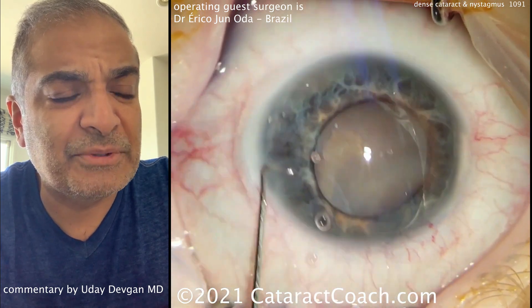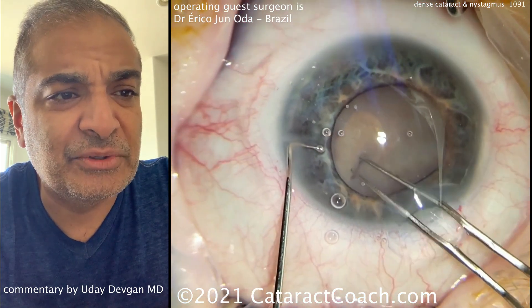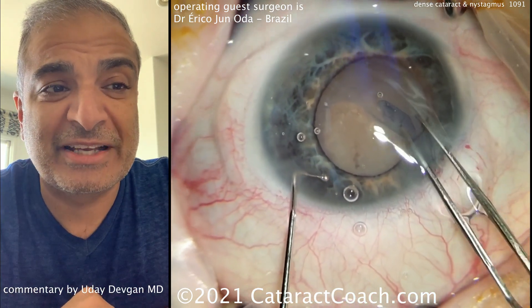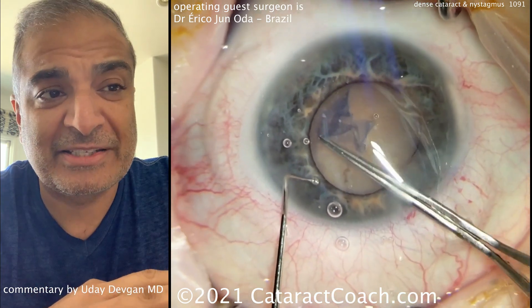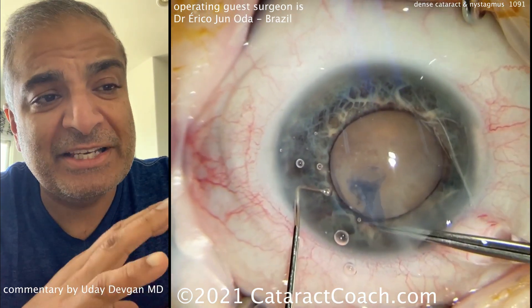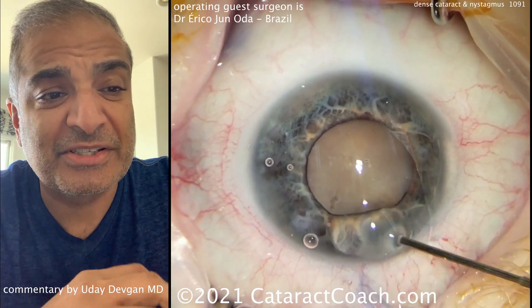This is important. There's a little amputation of it there, which is of no consequence — you can go back in, re-grab that same spot and continue. You definitely want an intact capsulorhexis for a case like this, and you definitely want a big one. With a really dense brunescent cataract, even if it's a six millimeter capsulorhexis, even if it doesn't perfectly overlap the optic, it's just much easier to get a dense cataract out of the capsular bag, especially with that much nuclear sclerosis.